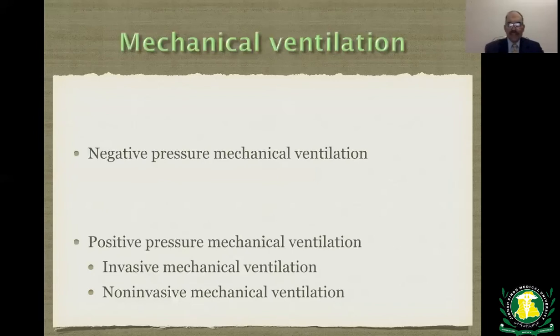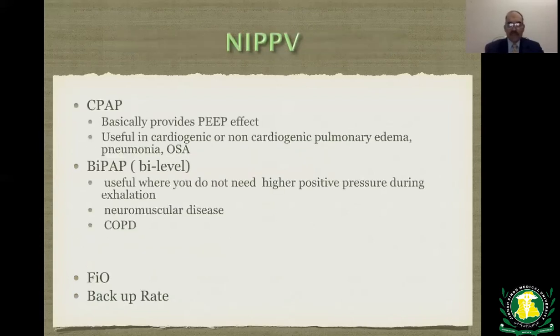Mechanical ventilation. Negative pressure mechanical ventilation, which we don't use anymore. Positive pressure mechanical ventilation could be invasive or non-invasive. I'm briefly going to talk about non-invasive positive pressure ventilation.